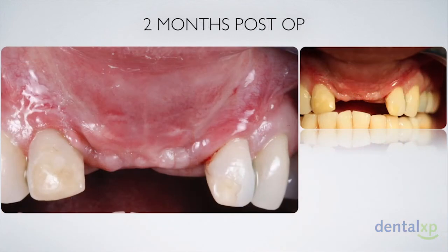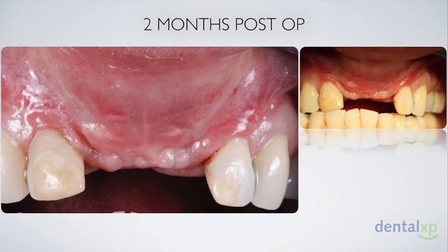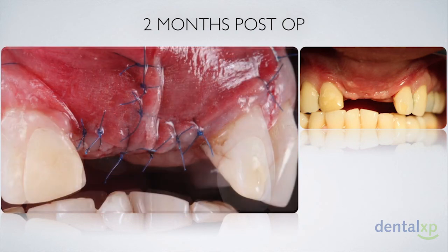So again, resulting from those augmentations, we sometimes end up with significant discrepancies of the mucogingival junction. And in this case, we proceeded with the same technique as shown before, with an apically positioned flap to allow restoration of the vestibular depth, keeping a band of keratinized tissue all around the site boundaries. The mucograft was then sutured.